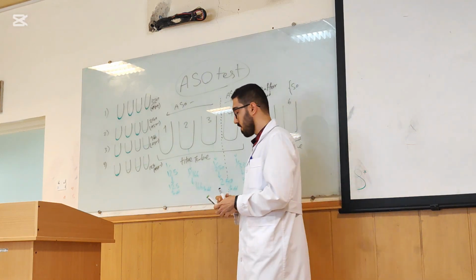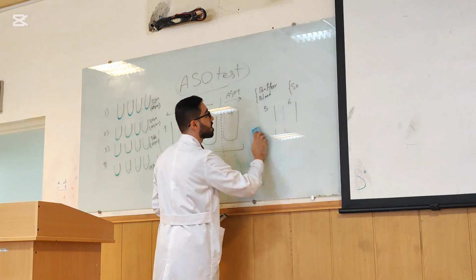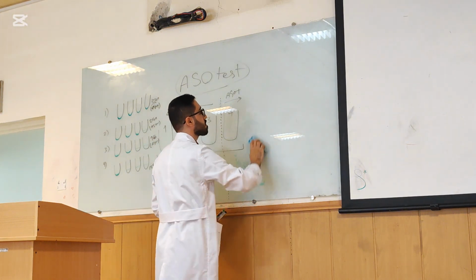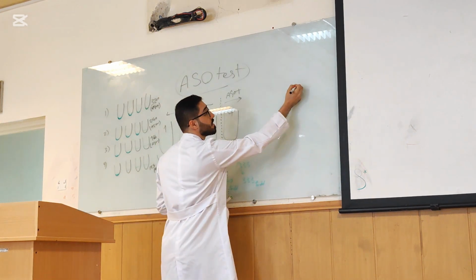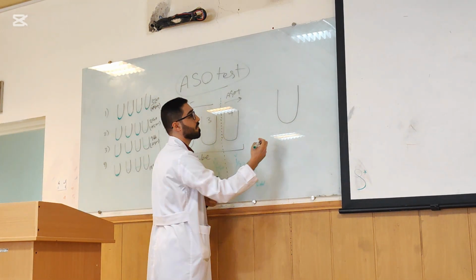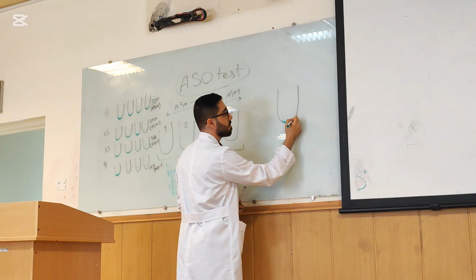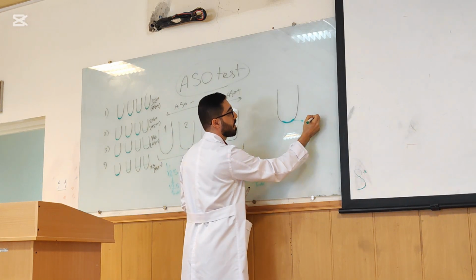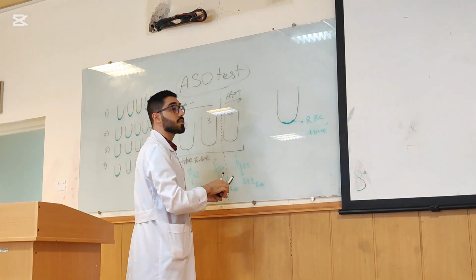Because this is your tube. Okay? We have no lysis. This is RBC at the bottom of the tube, and it is alive, not damaged. It's not good.